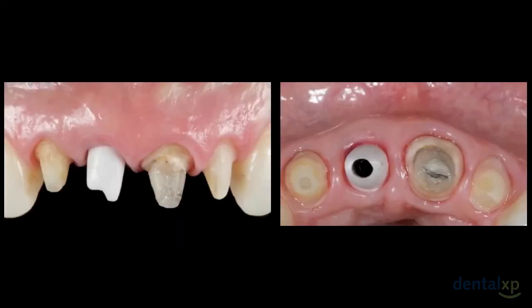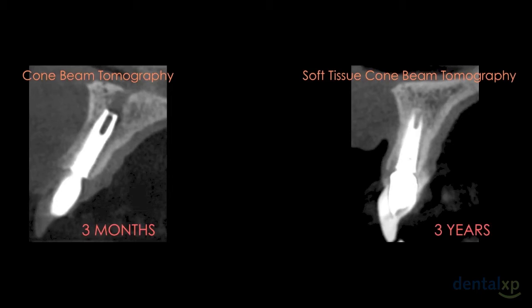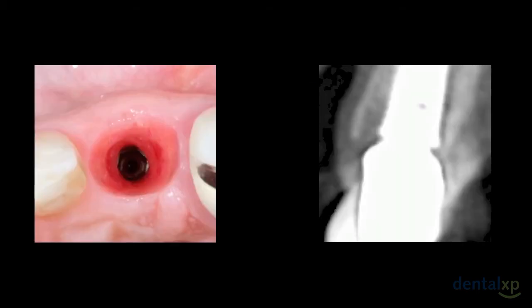The zirconia abutment was inserted, and we can observe the leveling of the gingival margin and the relevant volume of soft tissue. The final ceramic crowns were delivered. In a comparison of buccal bone wall thickness at three months and three years after the IDR procedure, the CBCT and clinical images show a favorable outcome. The platform-switching abutment provided good peri-implant hard tissue thickness and excellent volume of soft tissue.